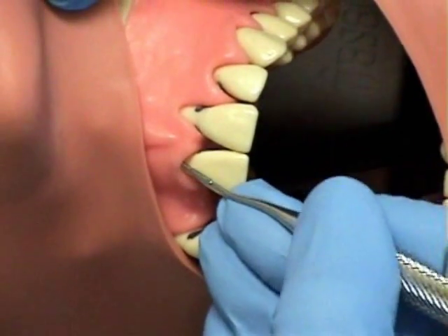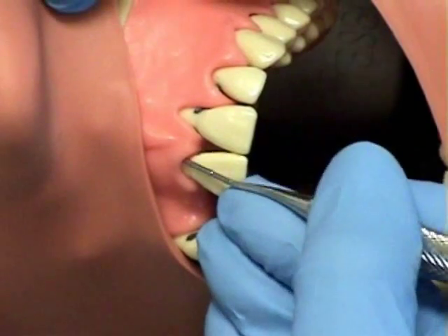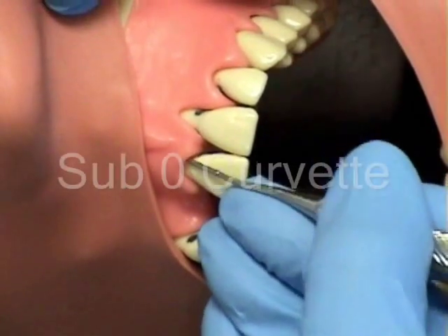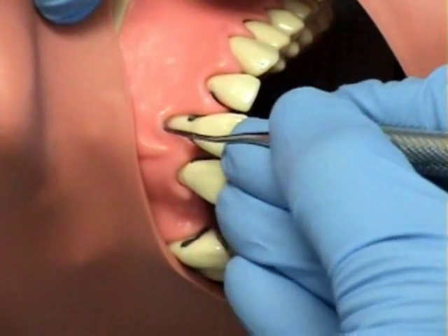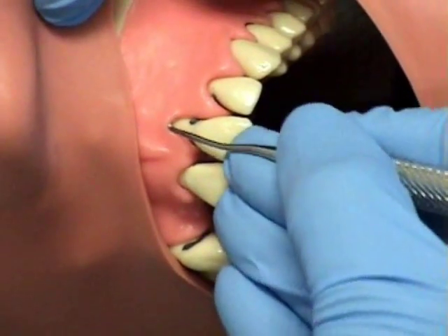The Sub-Zero, which has a long shank, is excellent for facial and lingual line angles on anteriors and premolars. That is the instrument being used at the present time.